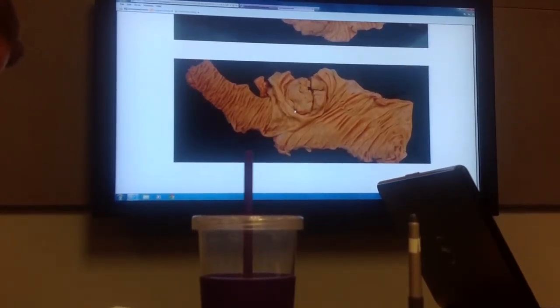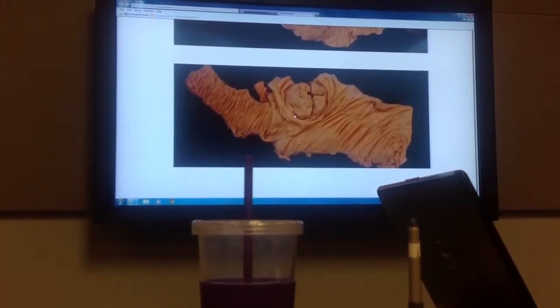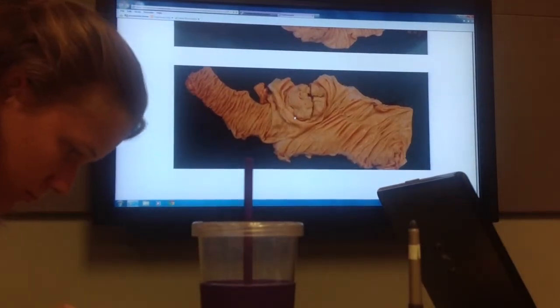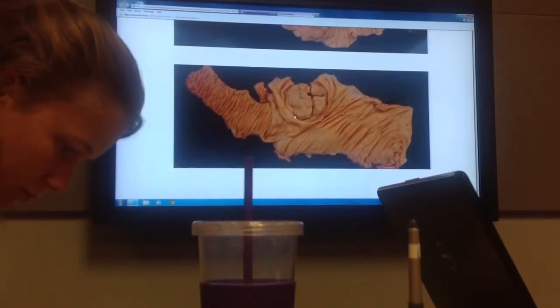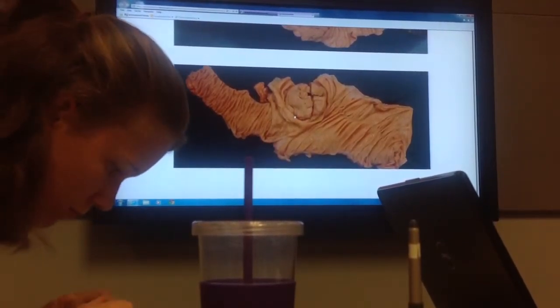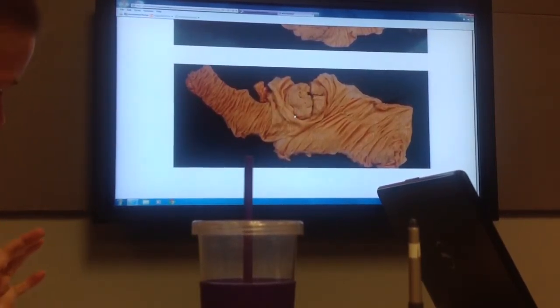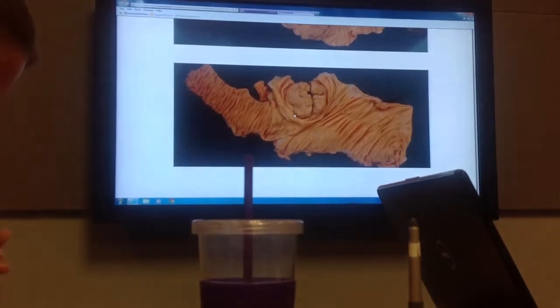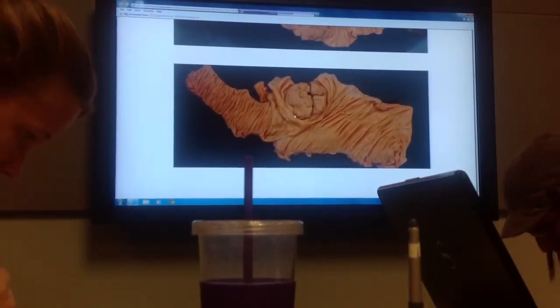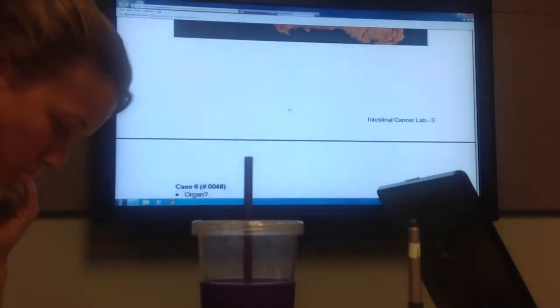Okay, but without the immunostains, just tumor, you couldn't do it, and that's one of the reasons why we started doing it, because a lot of these are being missed. It used to be, there's all these criteria, the Amsterdam criteria, the modified, the Bethesda and all this stuff. You'd have to go by family members affected and different things, and have your blood tested for microsatellite instability. And now we're testing endometrial cancers in young women, women under 40, and anybody with colorectal. So it's harder than it was previously thought.